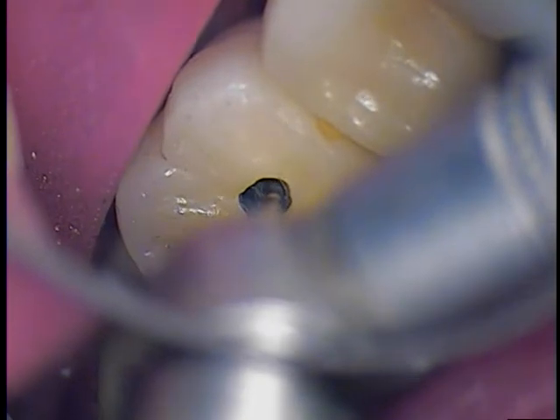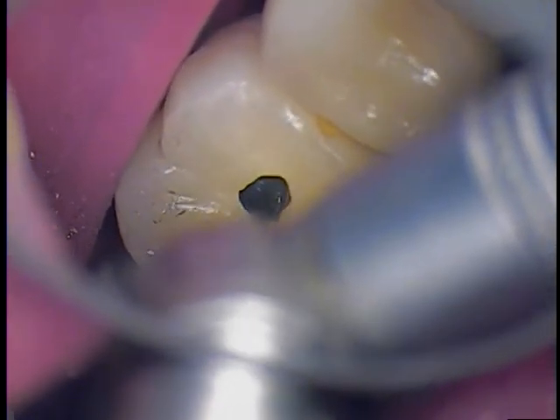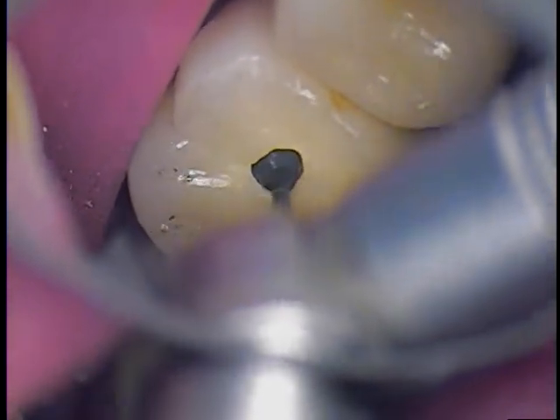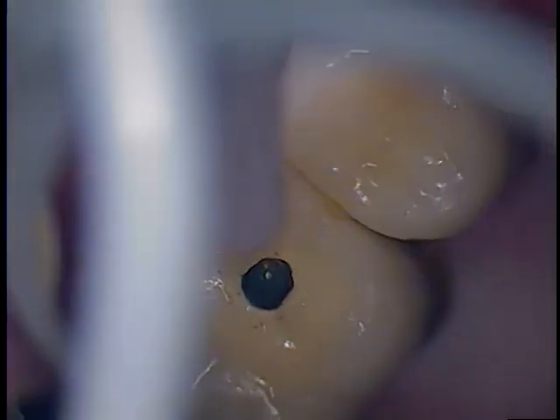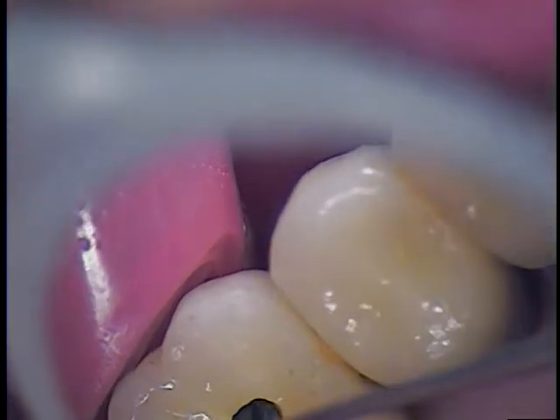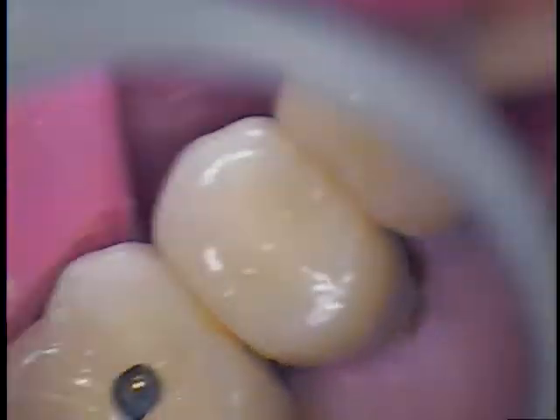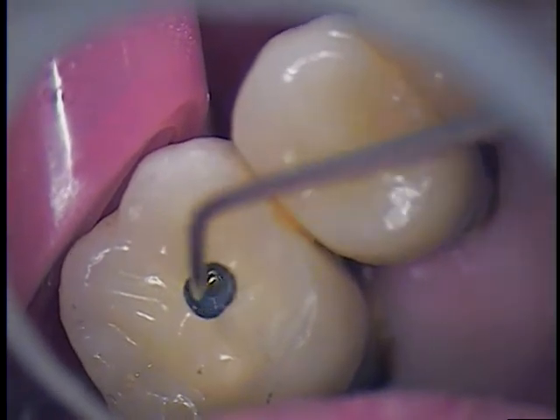We're hoping to find out if it's Teflon or if it's just cement. What are we looking at as far as the cover? I couldn't have done it any better — that one's right where it is. So there's some kind of a composite. We'll go ahead and dry that off and take an Explorer just to get a feel for where the opening is. Oh, look at that right there. Now let's find out what that is — is that the top of the abutment, or is that actually a screw?